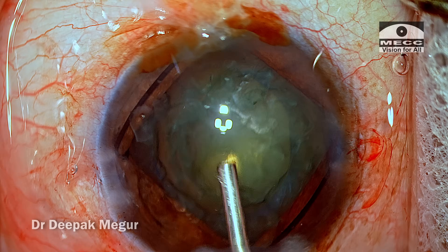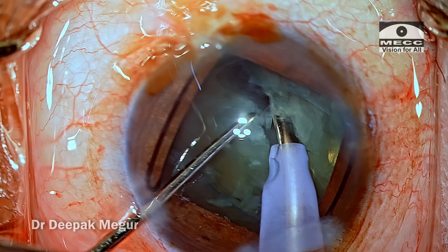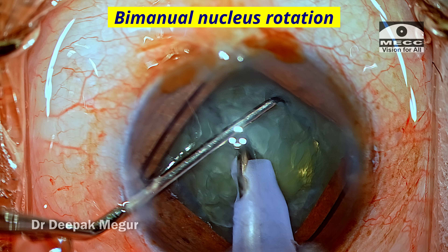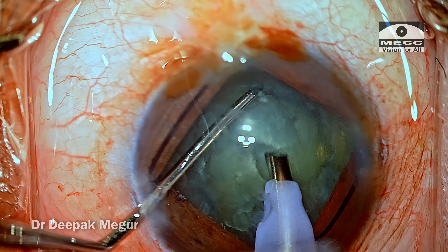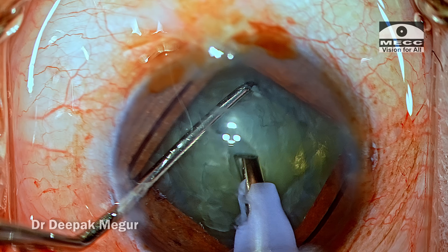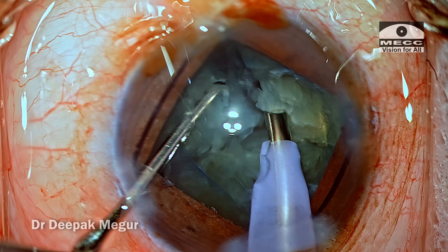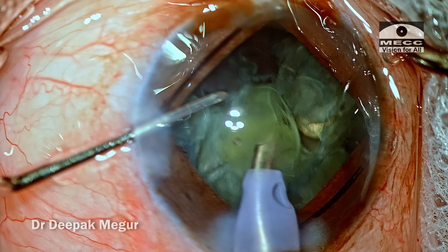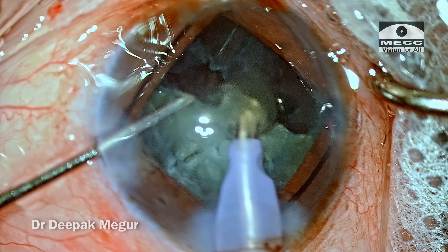This nucleus is not dense — luckily it's about grade 3 — and I'm going to use the direct chop technique to divide the nucleus. The first chop is done. When I'm trying to rotate the nucleus, I'm using a bimanual way of maneuvering — both the chopper and my phaco tip are being used to rotate the nucleus. This helps maneuver the nucleus in a much more efficient way without causing undue stress on the capsular bag, especially useful in these eyes with lax zonules. Since the nucleus is relatively soft, it's straightforward to divide into multiple smaller fragments, each pulled out of the bag and emulsified in a very controlled manner.